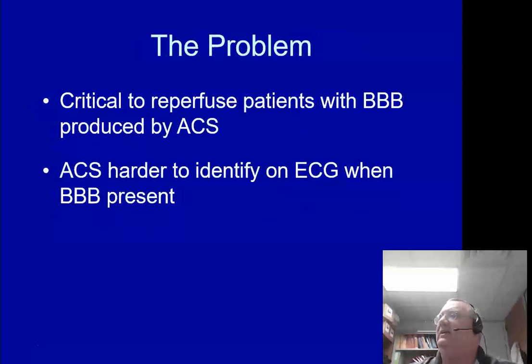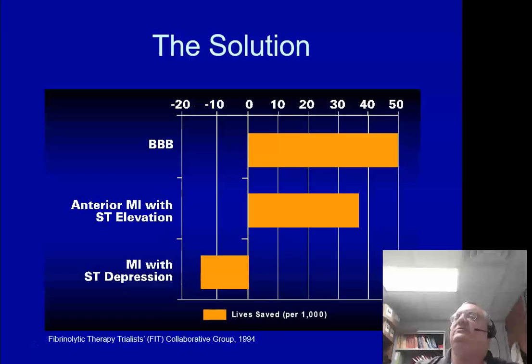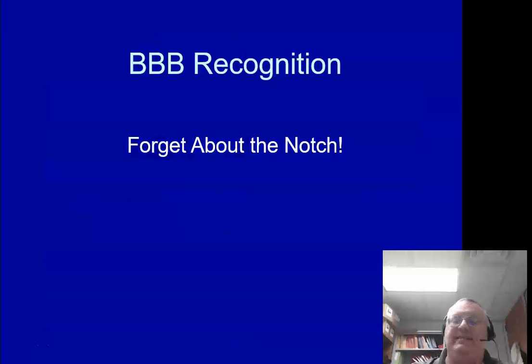And the problem is it's critical to reperfuse these patients, okay? But it's harder to identify if they actually need the early reperfusion therapy, okay? Again, I stress, get that 12 lead or that 15 lead to the doctor and have him take a look at it.